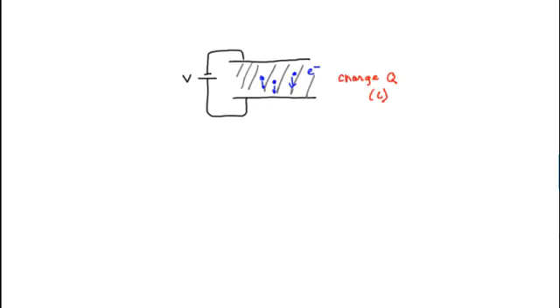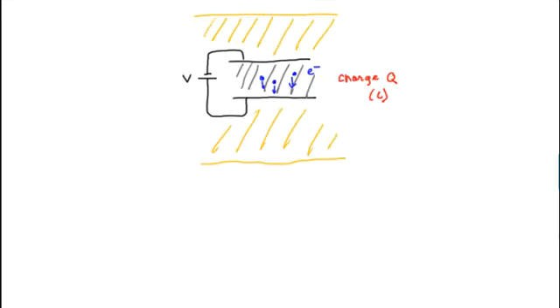Okay, and another thing to note then is that this chamber doesn't sit out in air, it's not just floating around. It's in some medium, either water or plastic, and then you're measuring the beam in that. So a photon comes in, interacts in this medium, it Compton scatters and makes an electron, or scatters an electron into the chamber, and that's what you measure for the charge.